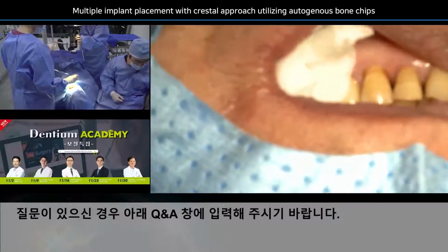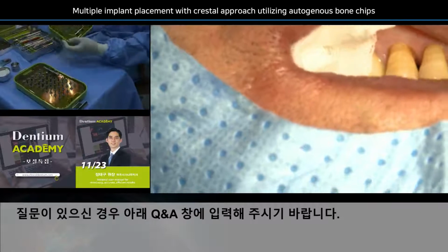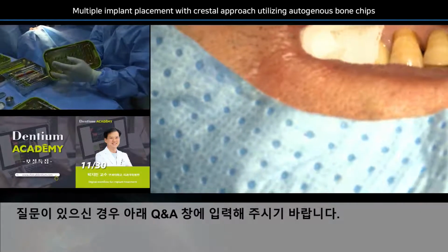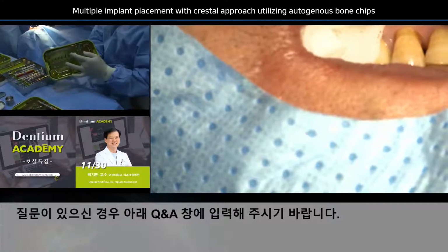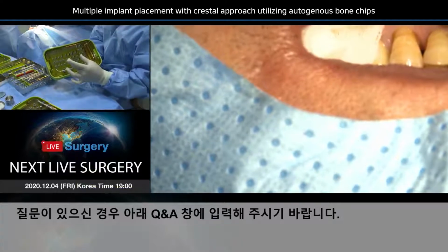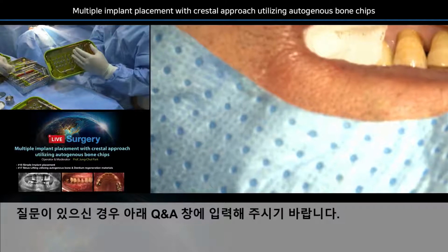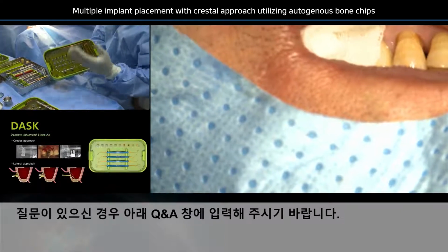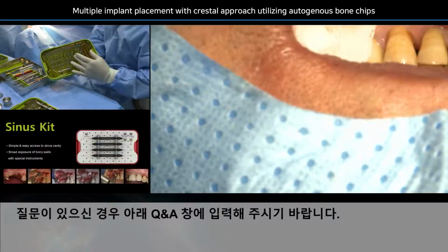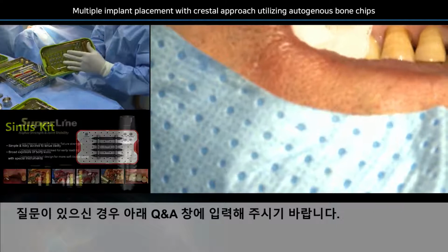These are the osteotomy tools from Dentium. This is the conventional old Dentium drills without any stoppers. So there are actually 12, yes, 6 long drills and 6 short drills. And these drills do not have a stopper, so sometimes you can make some accidents by going too deep to the sinus cavity or to the inferior alveolar nerve. But this is a classic. A lot of experienced surgeons prefer this one.